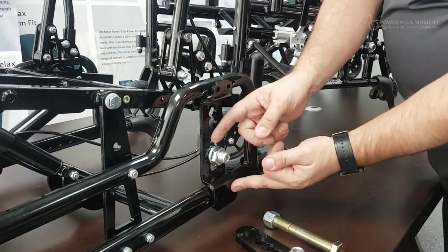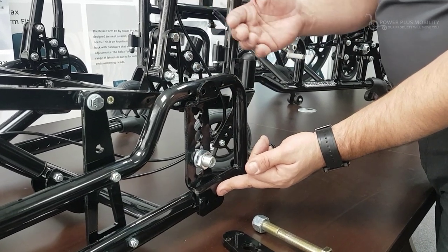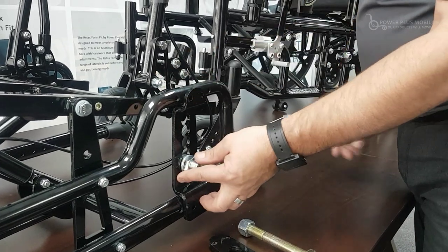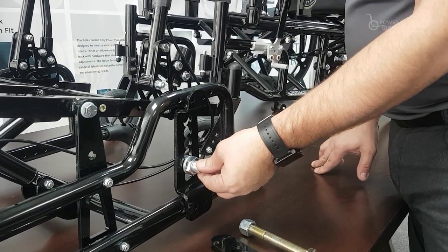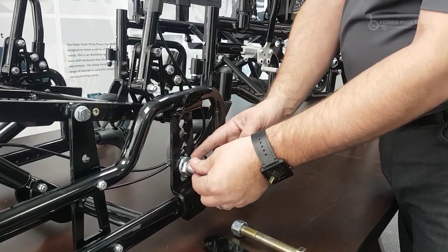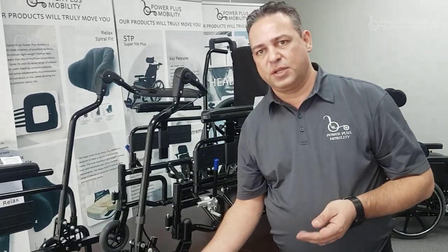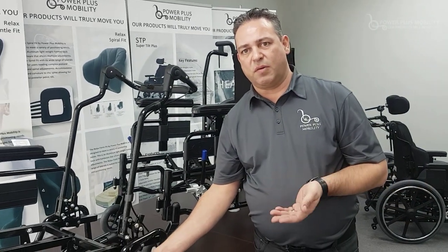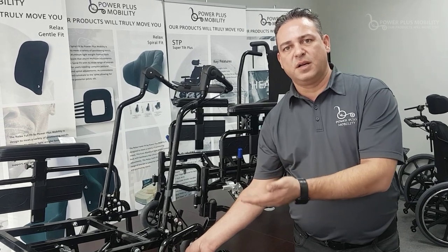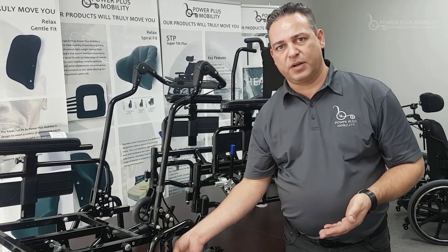By doing this we've taken one inch of width away from the wheels, narrowing the chair. This is our new axle plate used on our STP. It slides forward and back, and we have five slots of height adjustability. The seat-to-floor height range goes as low as 12.5 inches with 20-inch rear wheels, up to 19.5 inches with this rear axle configuration.